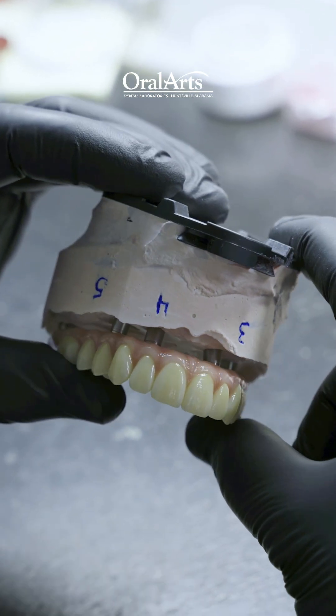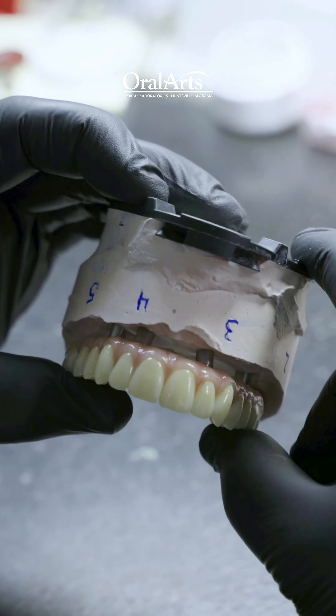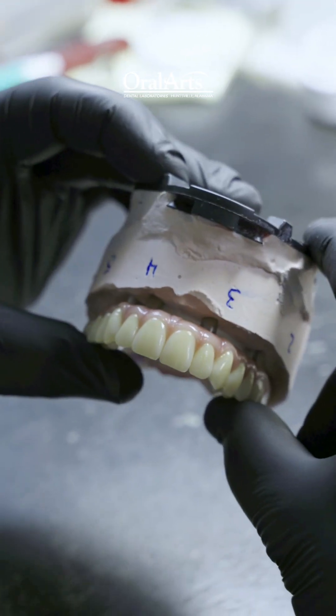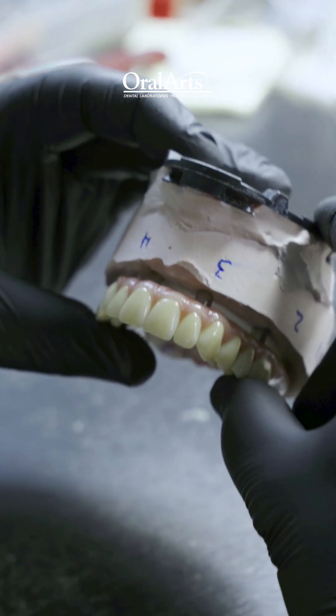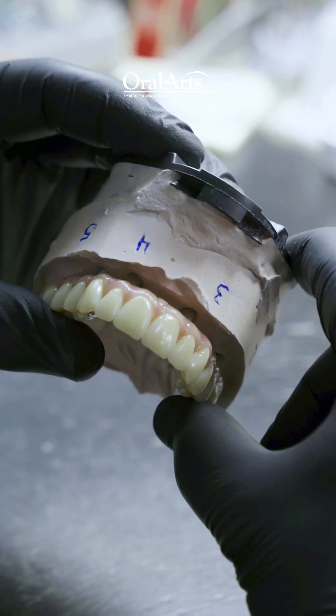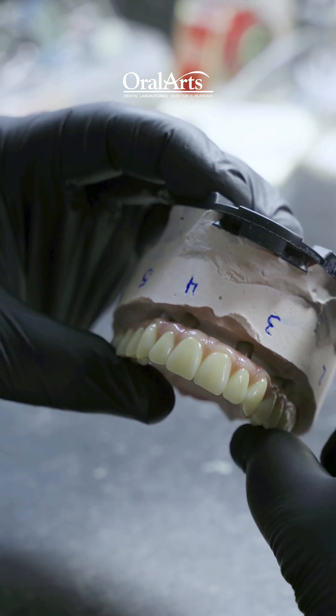This can be screwed down and worn as a restoration for this patient for years and years to come, enhancing their general oral aesthetics. Beautiful smile, beautiful utility out of this — they'll be able to eat steaks and whatever their hearts desire.